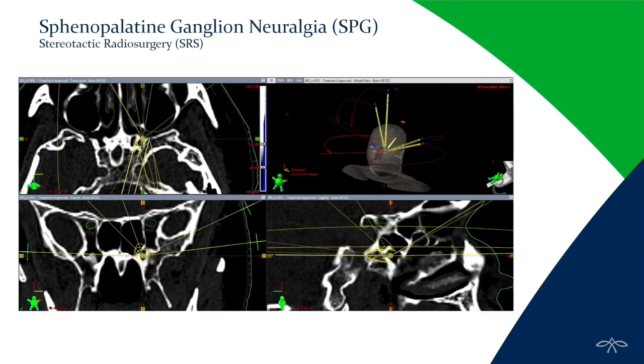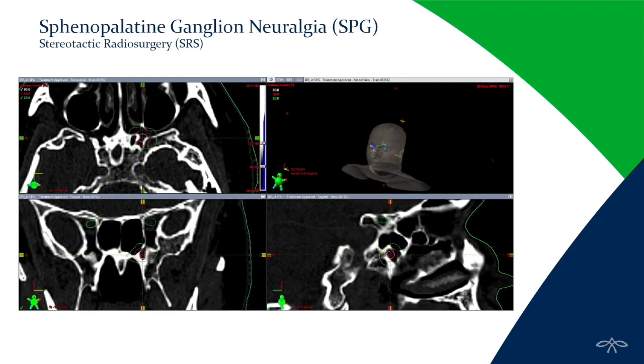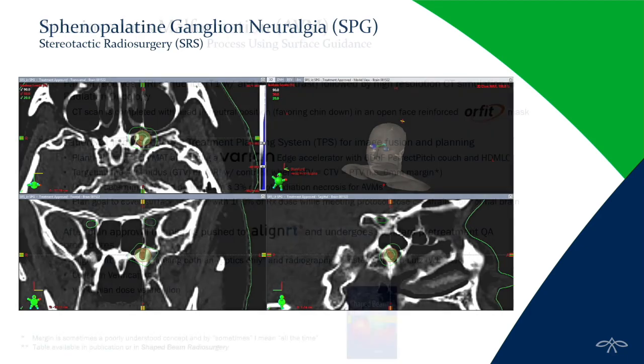We target that canal, there's no MRI. We have a dose distribution centered on that canal, which you see in red, and then you have a dose distribution that's slightly larger than your trigem, and that green area is essentially the 50% line that we're trying to encompass the entire bony foramen with the 90 gray centered on isocenter.